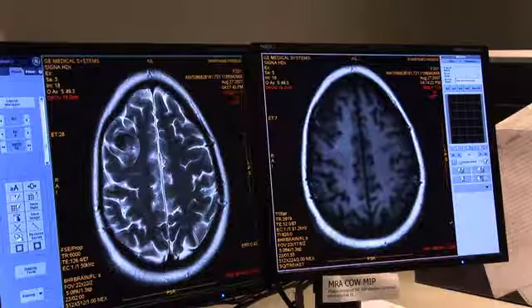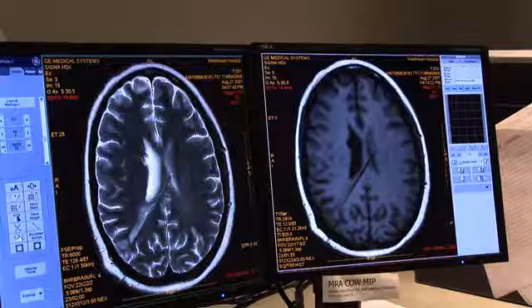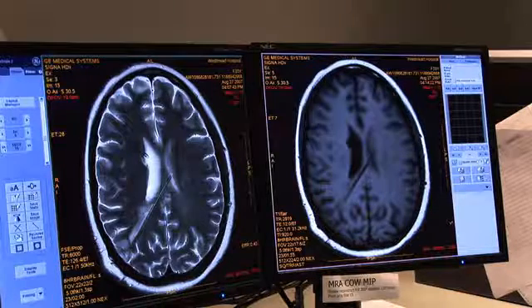A contrast agent is often used to improve the image. Water can be taken orally for imaging the stomach and small intestine. More commonly, a paramagnetic contrast agent is given. Gadolinium is a common example.